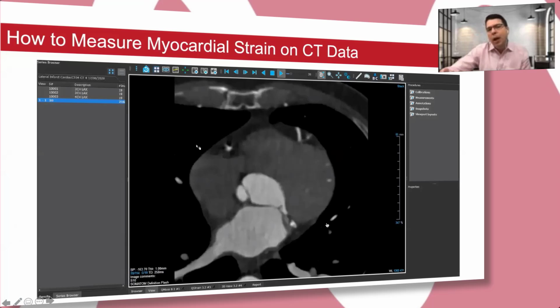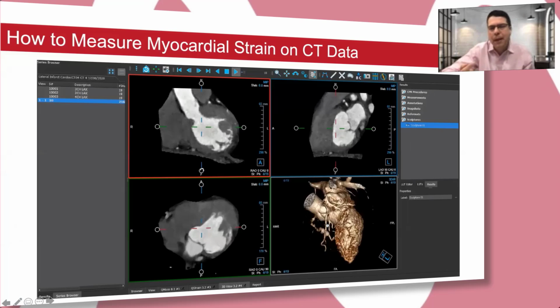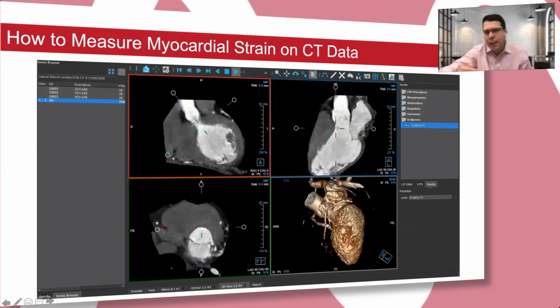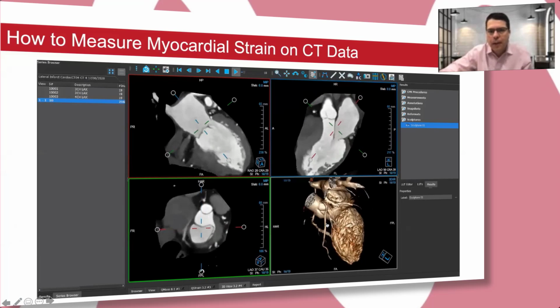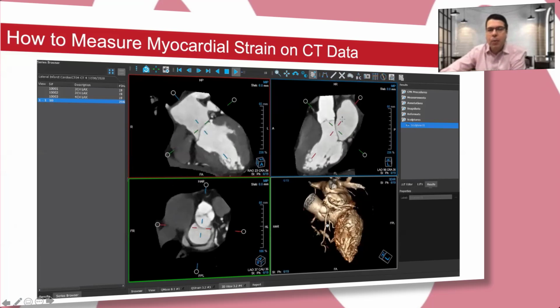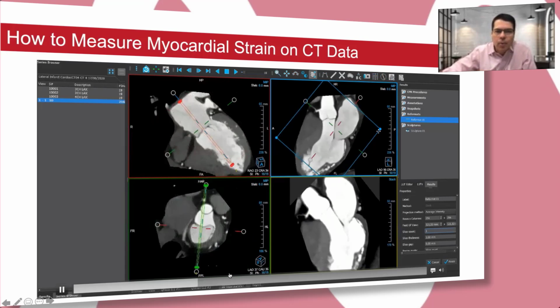Now, moving into how we're going to use CT, we acquire this cardiac acquisition throughout the cardiac cycle, what we call retrospective acquisition. We want to have contrast on the left side. Then we take this whole data set and use these double oblique multiplanar reformats to create the cardiac planes. Here in this case, the crosshair is going to the mitral valve annular plane centroid, cutting through the LV apex. With this, we create, for example, the 3-chamber. We're cutting through the LV apex and on the short axis, cutting through the aortic valve.